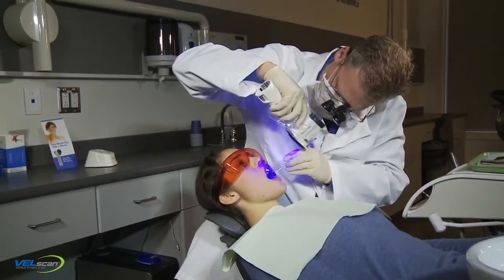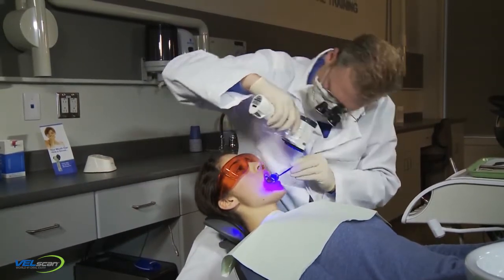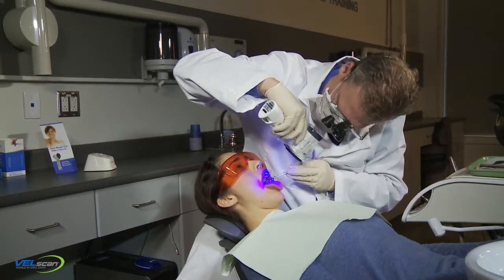The white light exam and the VELscope VX exam are analogous procedures with comparable objectives: the discovery of potential abnormalities that may require further investigation. The power of the VELscope VX is its sensitivity to detect subtle mucosal changes that help clinicians detect abnormal areas that might have been overlooked during the conventional exam.